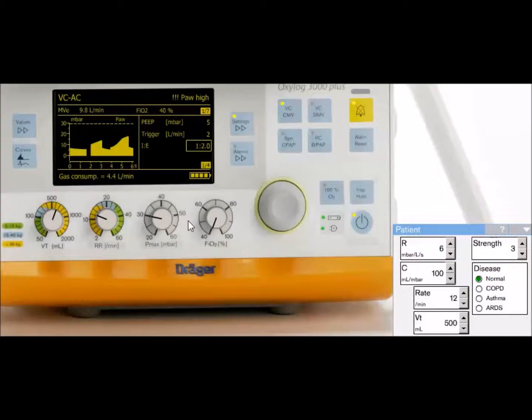So an example is, does my breath prematurely cycle? Say my patient's compliance changes. It's going to hit this Pmax value, and with a high pressure alarm, it's just going to end the breath. It hits this, it's going to open up the exhalation valve, it's going to end the breath. But what the pressure limiting does is it just limits that pressure. However, it keeps the same inspiratory time. So the patient gets more of a delivered breath than a prematurely ending one. And I'm going to show this in a couple more slides.